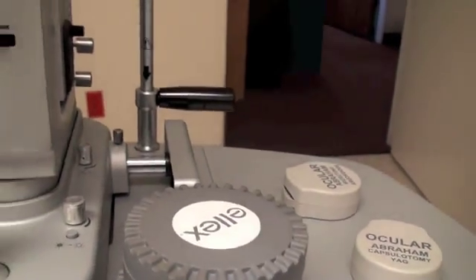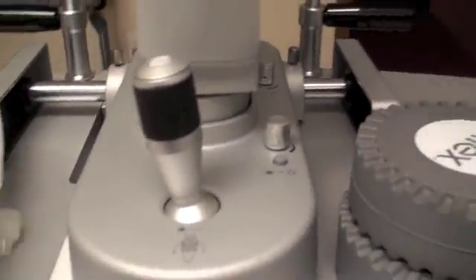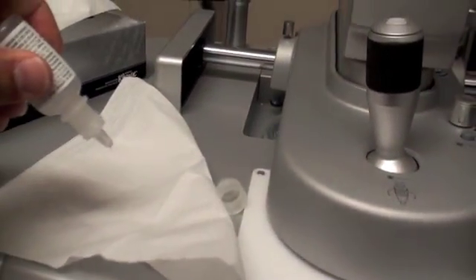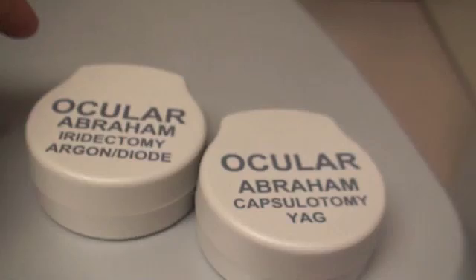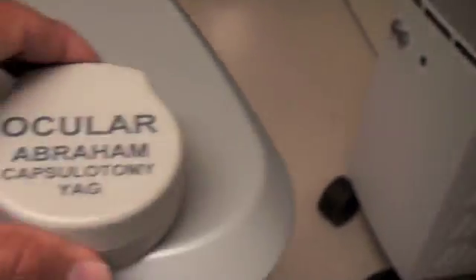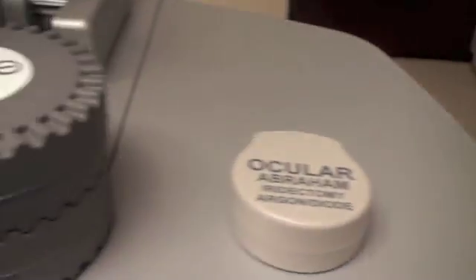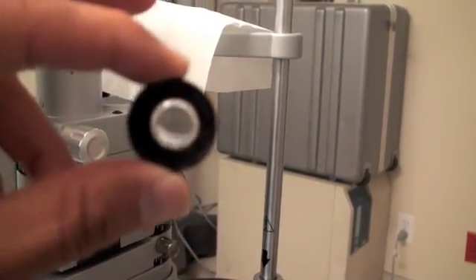We do put this nice gooey jelly into your eye so that it doesn't hurt. I'll show you its consistency — that's the consistency. It's hydrocellulose or goniosol, and that goes into one of these two lenses which are put on top of your eye, and it's not painful. If we are doing a capsulotomy, which is YAG, then we use the YAG lens. The jelly goes on the back side of this lens and it sits on the eye.